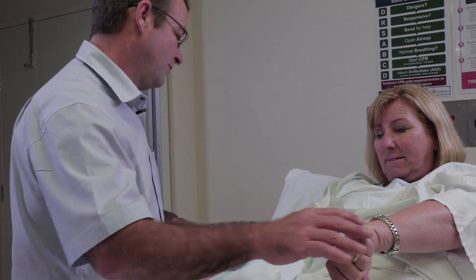Hello Mrs Thirst, I'm Darren, I'm one of the nursing staff. They've asked me to come and pop a drip in your arm today. Oh, looks like they've had a couple of goes, you poor thing, hey? Alright, let's see how we go.